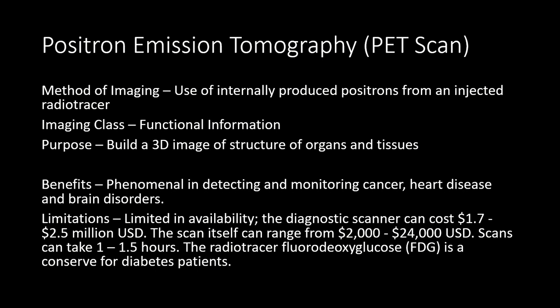Therefore, cancerous regions, which are trying to hoard a lot of resources, will show a lot of positron activity being released from the absorbed portions due to the cancer cells hoarding ingredients. The release of positrons, once that radio tracer is absorbed, will help diagnose and determine the severity of cancer.